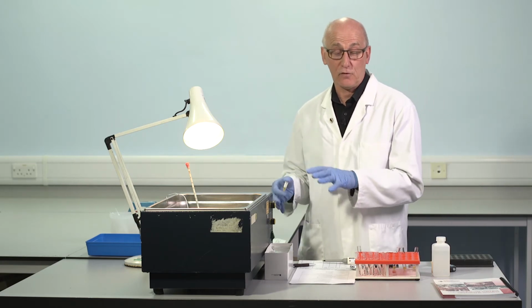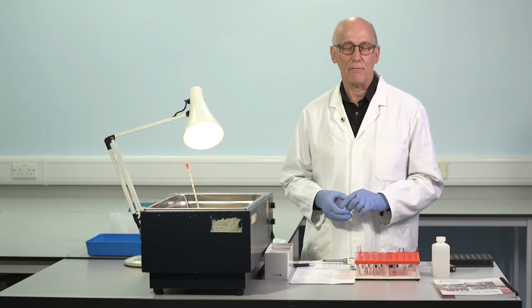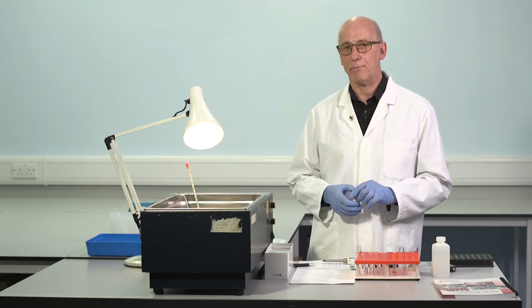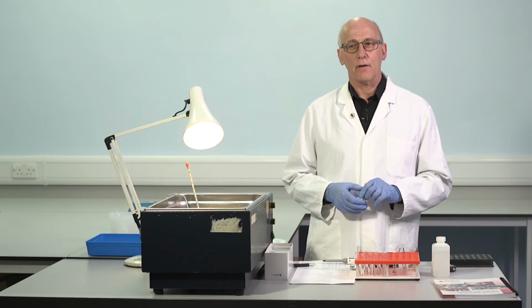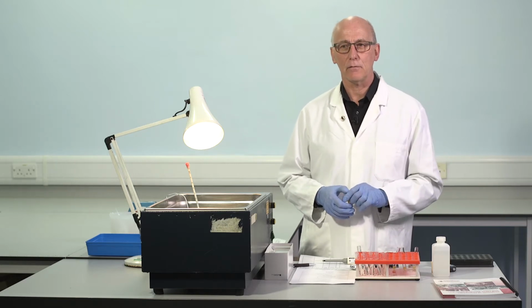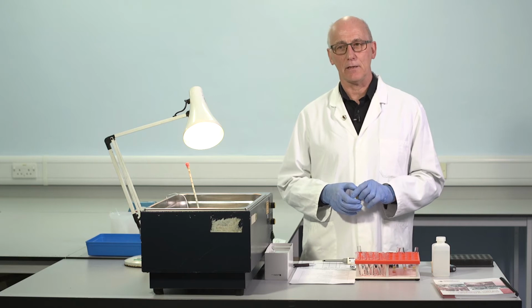And we've shown for our own method that the process of freeze and thaw introduces no changes in the level of factor VIII, provided, of course, we use appropriate storage conditions. And that really means sufficiently cold. We noticed that the majority of -20 freezers really aren't adequate for storing frozen samples for factor VIII assays, particularly if those are domestic grade freezers.